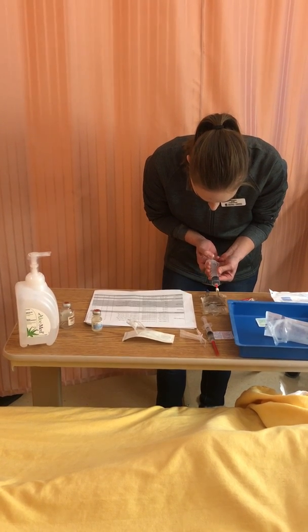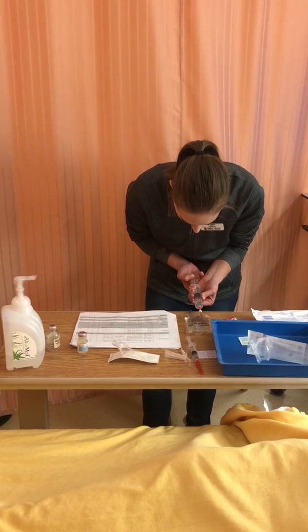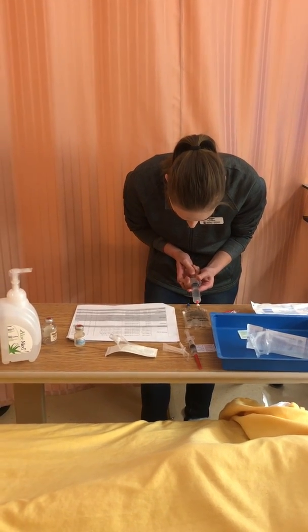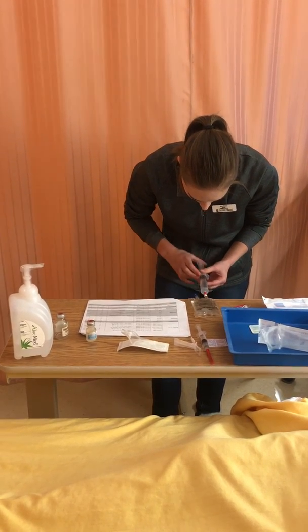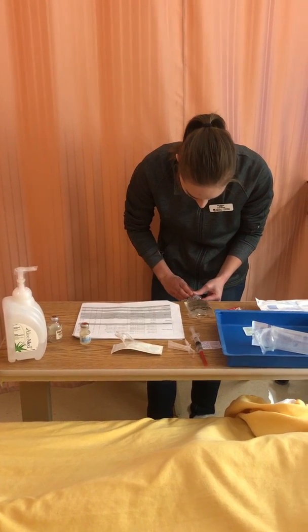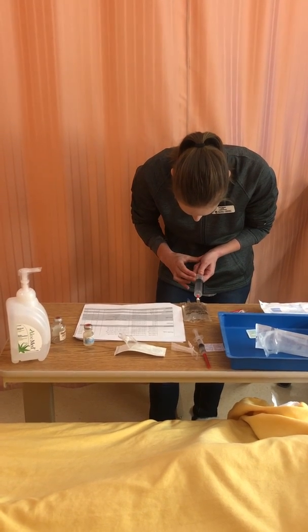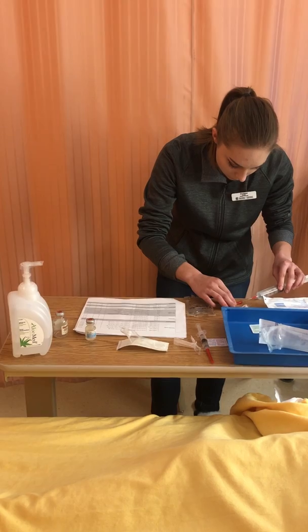Hi, Mr. Carlo. My name is Tayo. I'm a student nurse. I'll be administering your medication today. How are you? Can you please tell me your name and your date of birth? Okay. Since I'm here now, I'm going to check the site to make sure that everything looks good. There is no infiltration or redness, and it's not pink. The primary line is running well.